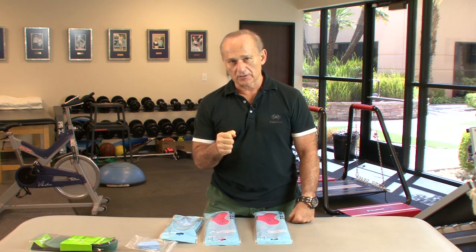Most of my athletes who really pound the pavement in running, in sports that are aggressive, such as basketball, tennis, where they're doing a lot of running and cutting, that's the kind of density I'd like to see, because I want to try to control that foot so we don't go into excessive pronation.